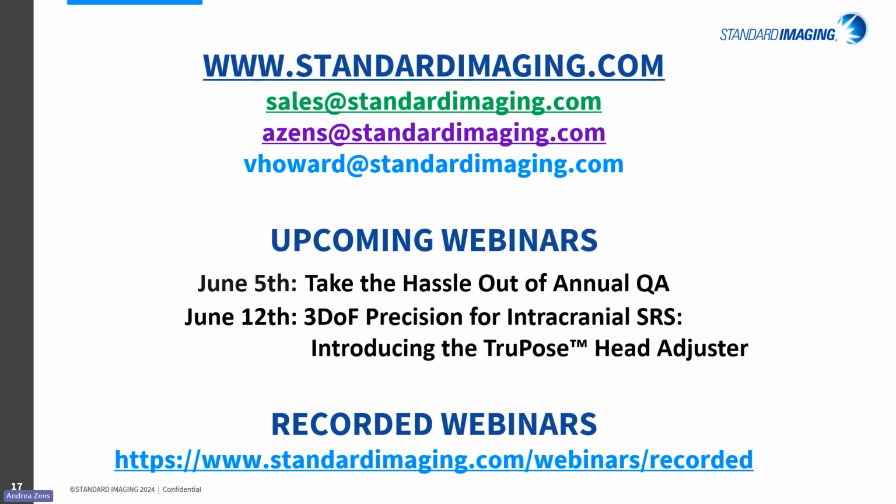So really it is an upgrade to the AQA. And the nice thing about ours, again, is the single setup of the device on the couch to begin with. And you do not need, quote unquote, optional accessories to be able to get the data that you need to have that more comprehensive test of the treatment localization system.